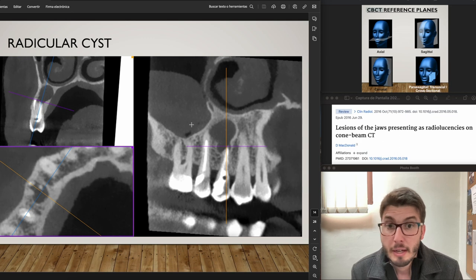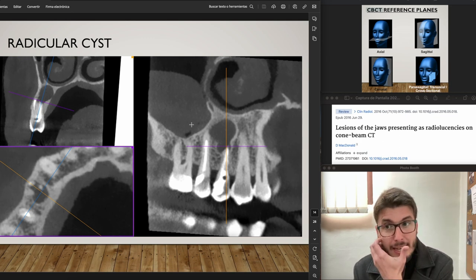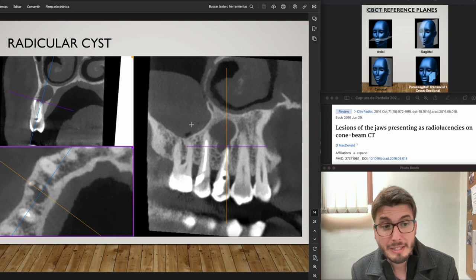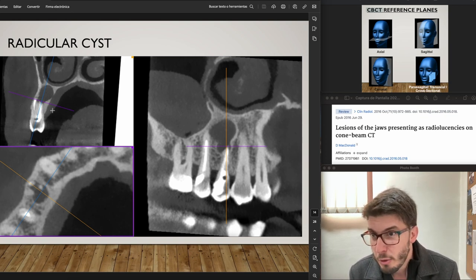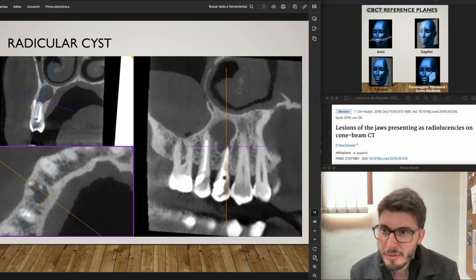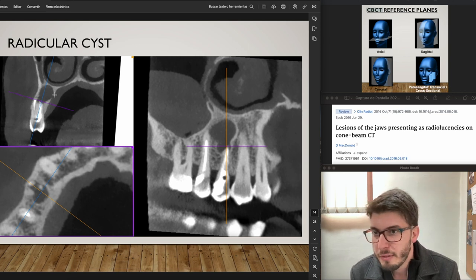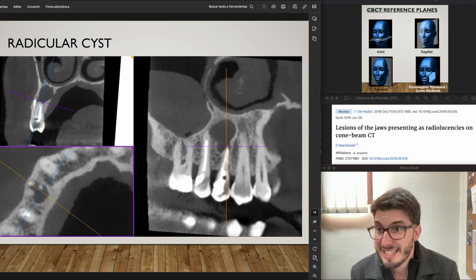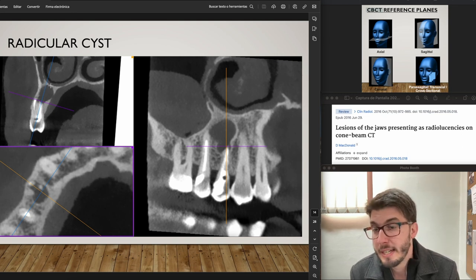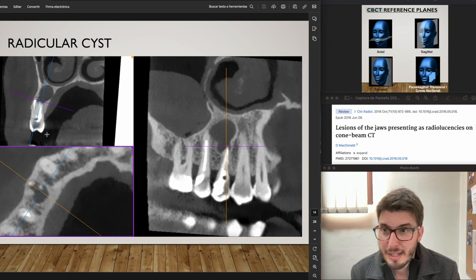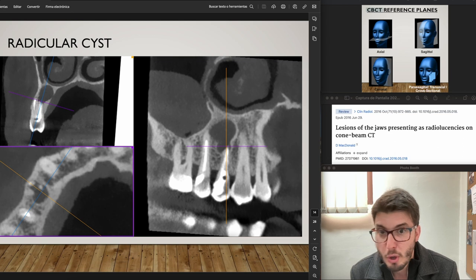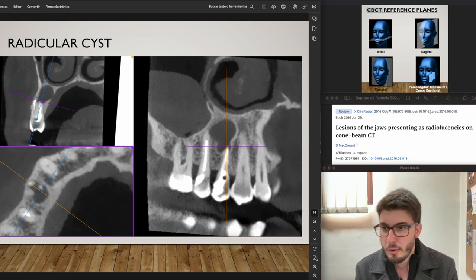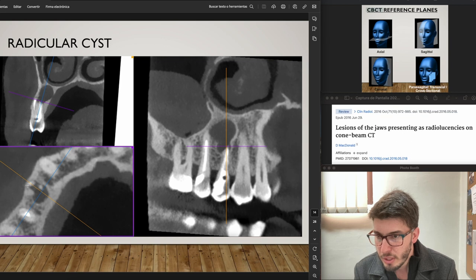Now radicular cysts — a case of radicular cysts. Again hypodense, well-limited, symmetric, with an inflammatory etiology. Maybe a little bit of root resorption is involved, but that's not common, with thinning of the palatal plate. The lesion extends up to the nasal floor and even the sinus floor, and is centralized on the palatal root of this first premolar, although the buccal root is also associated with the lesion.